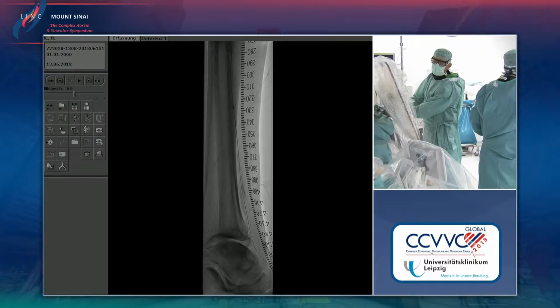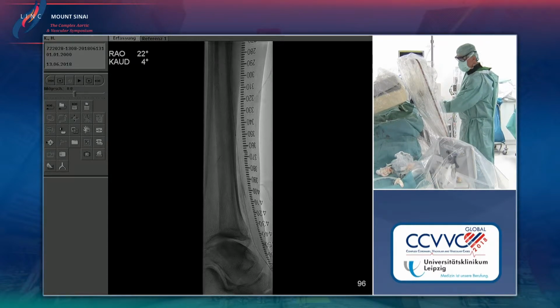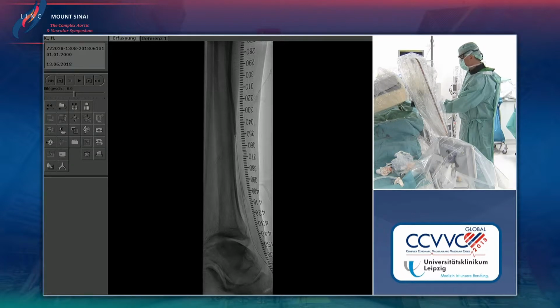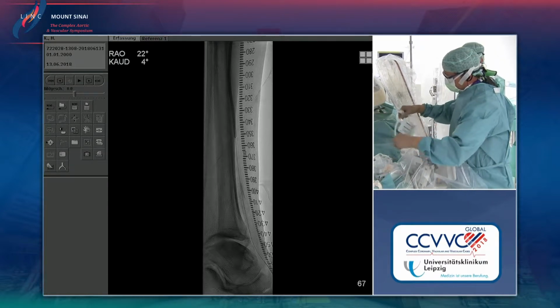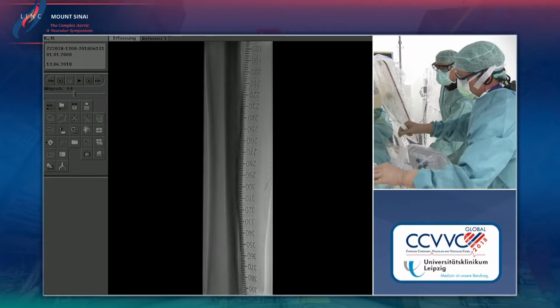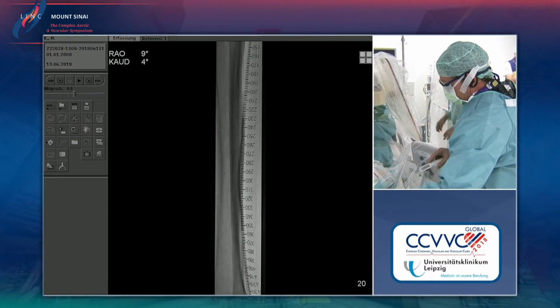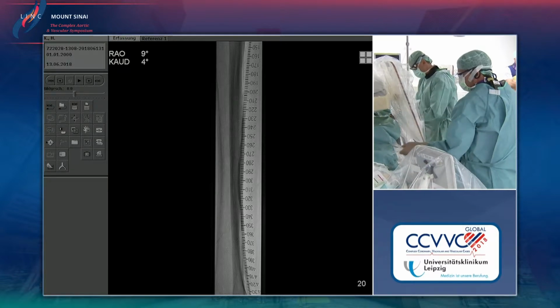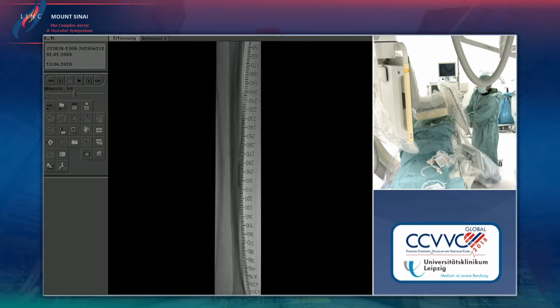The difficulty, I think, remains what we were talking about: when you have calcium, it's hard to get that little needle through. So you have to look for spaces, for that sweet spot where you could actually inject past the artery, which I believe would be impractical in very severely calcified vessels to begin with. You have to be very patient during the procedure and look for these spaces, like Andre. He's got an incredible amount of patience to do this.